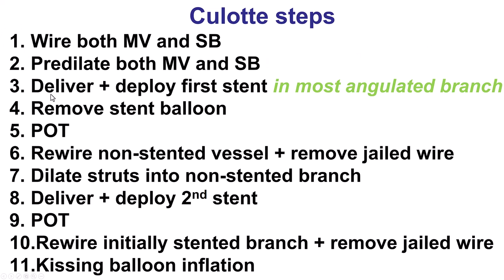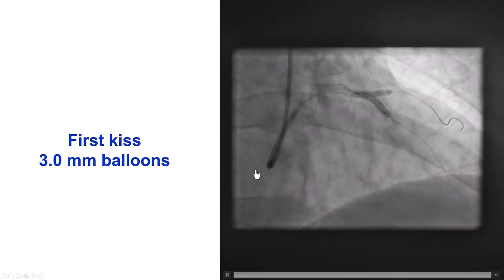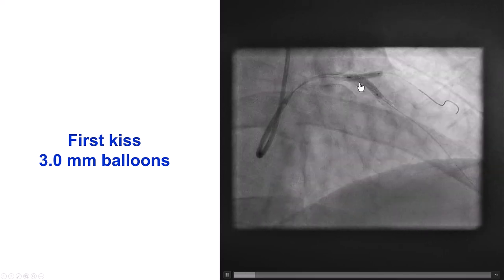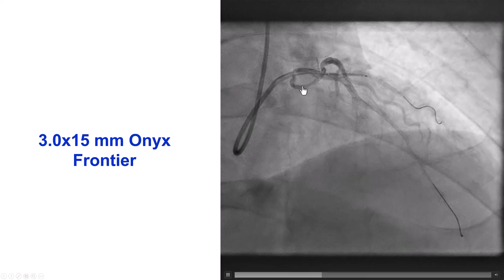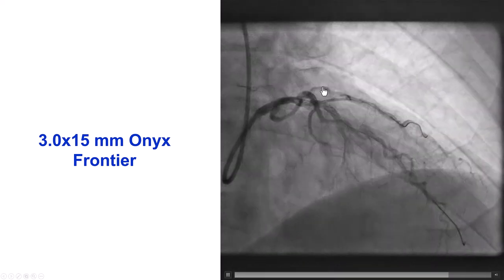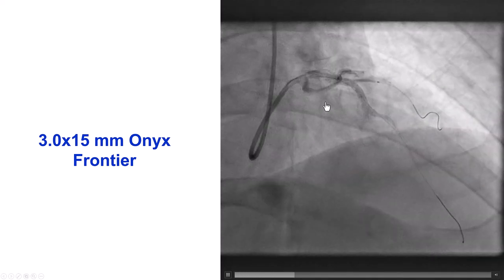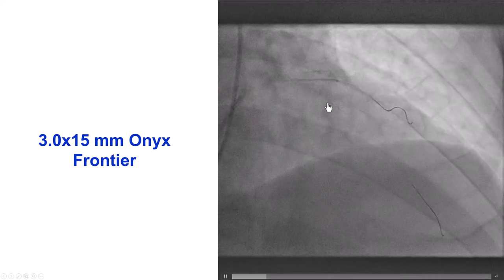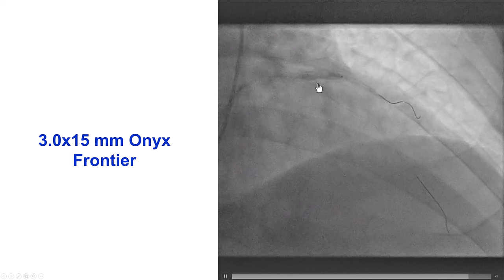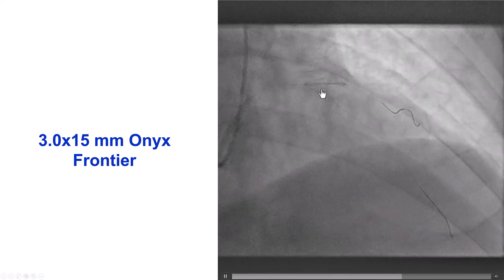The steps of the culotte technique are described separately in a different video. Essentially, both branches are wired. In our case, we have already delivered the first stent — not in the most angulated branch, as this is a bailout from provisional — but the first stent is in. Then we did POT, rewired the vessel, dilated the struts, deployed the second stent, performed proximal optimization, and rewired the initial stented branch. We rewired and did the first kissing balloon inflation with two 3.0 mm balloons in the diagonal and the LAD. We then placed a 3.0 by 15 mm Onyx Frontier from the diagonal going back into the LAD, creating a double-barrel or culotte segment in the proximal LAD. We tried to optimize the overlap to avoid excessive stent length proximally in the double-barrel area.